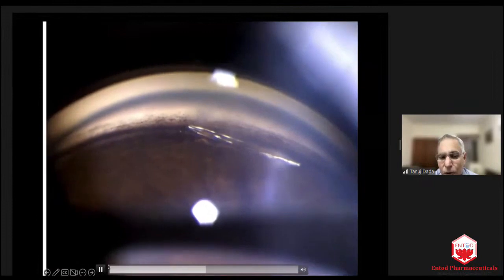So gonioscopy is very important later on for perforating injuries. Many times you will see a foreign body lodged in the angle. So not only for diagnosis, you have to do gonioscopy intraoperatively, and then under gonioscopy guidance, remove this foreign body. Wasn't there any external sign of injury? No, there was a self-sealed perforation. But nobody does gonioscopy, you know. Okay, perforation.